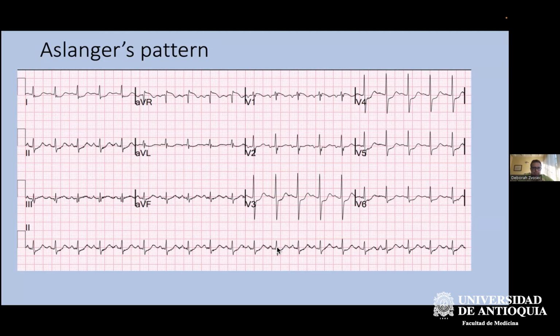And so now we have found a way of measuring the area under the curve on EKGs, and we are very close to submitting an article that shows that the area under the curve to the QRS size does indeed define hyperacute T waves. I don't have the entire results back yet, but we will be able to publish this fairly soon, and that will help. But it still won't be as good as using AI to recognize it.